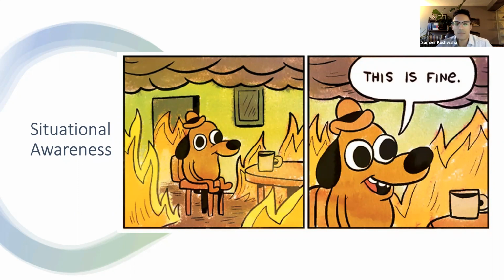For example, the information we provide can help to determine if there's an urgent cardiovascular or surgical issue, or understand the hemodynamics of the patient in preparation for an operation for another organ system. Ultimately, it's important to recognize that trauma is a team activity and we don't work in isolation, and we need to work in concert with all the other teams that are present.